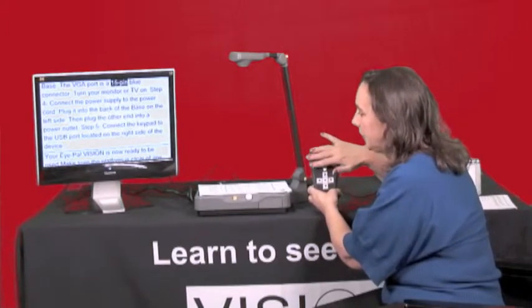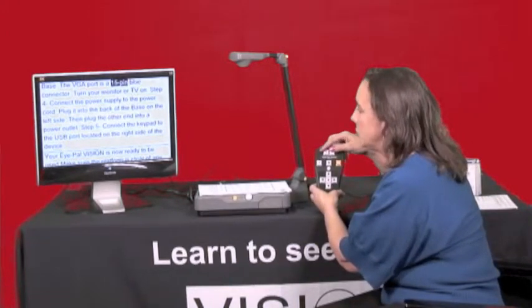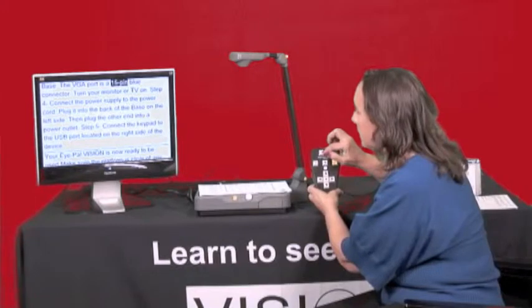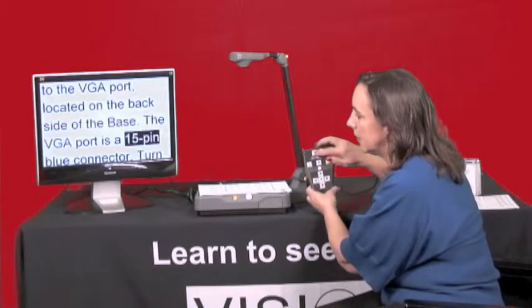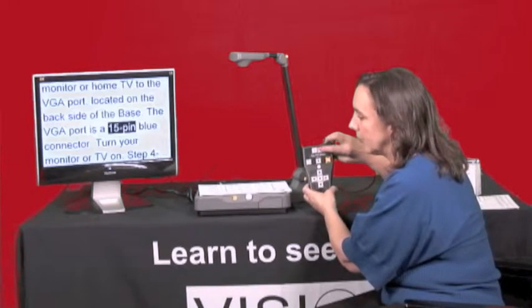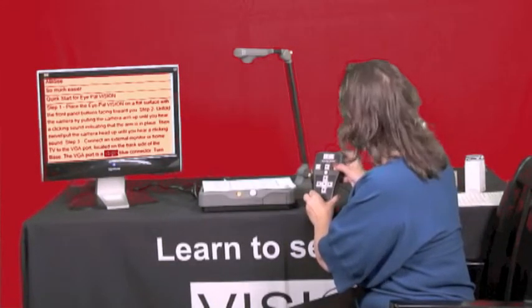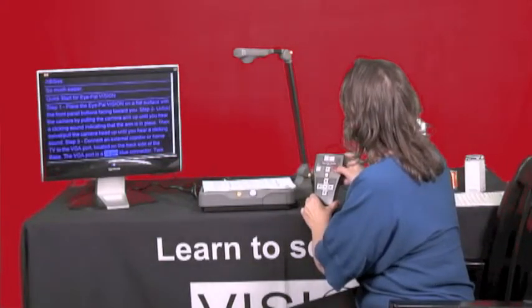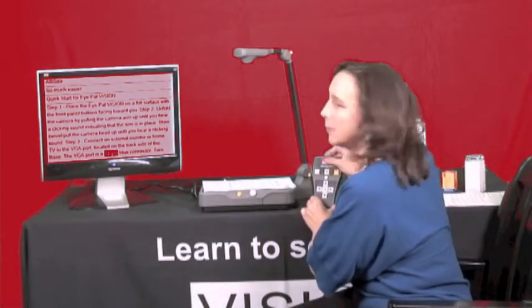Now the buttons on the top of the remote have more to do with what you're seeing on your monitor. All the way to the top left you have a square button with a plus sign on it — that's going to increase the size of the print on your monitor. The button to the right of that, a square button with a horizontal line on it, is going to reduce the size of the print. Moving clockwise around your keypad we come to a yellow square button — pressing that changes our color contrast on the monitor. I can move through and pick a color combination that looks good for me.